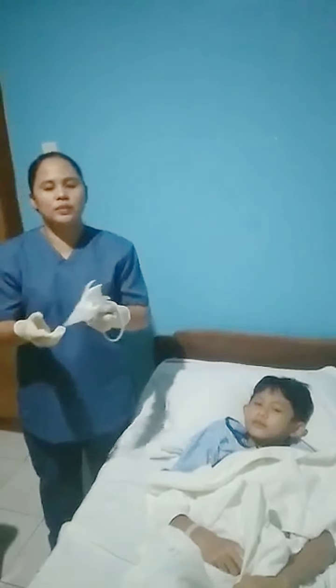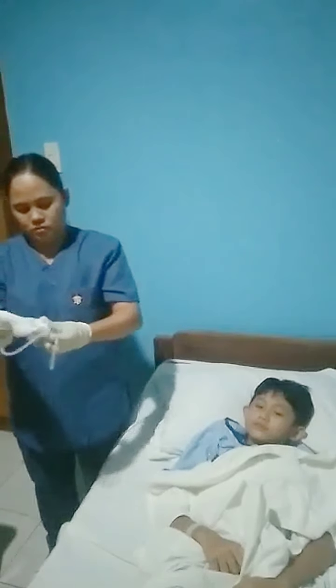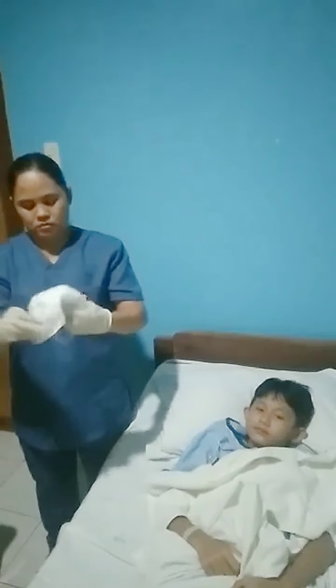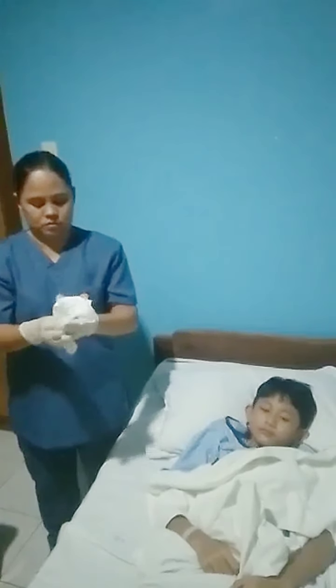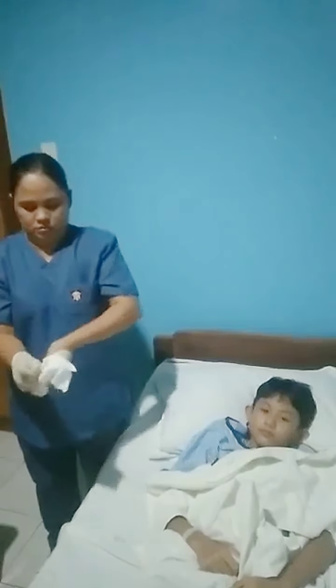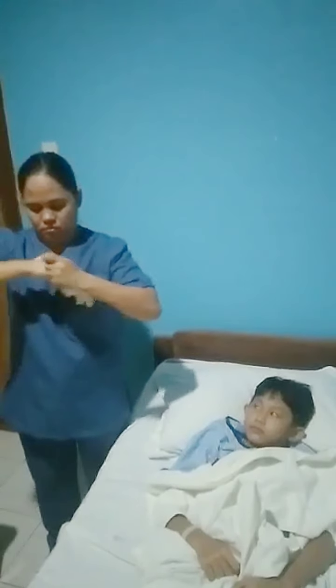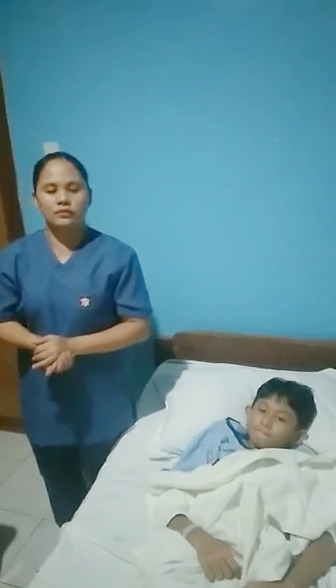Place the soiled tube in a paper towel and cover it, and you may now remove your gloves. Next is to provide comfort to our patient and give mouth care to remove secretions in the oral cavity.